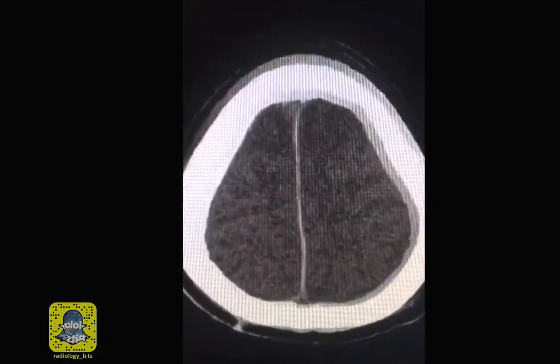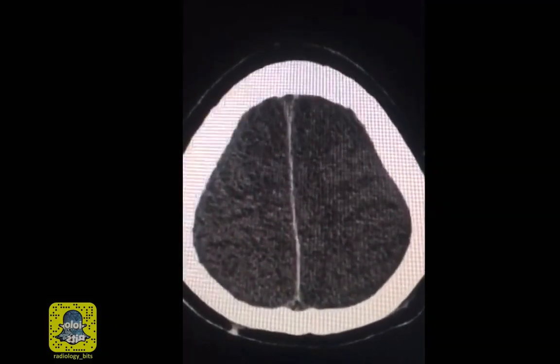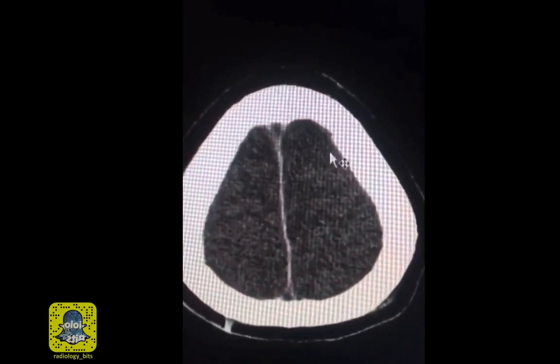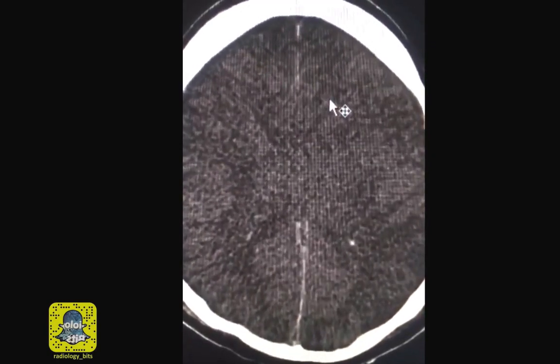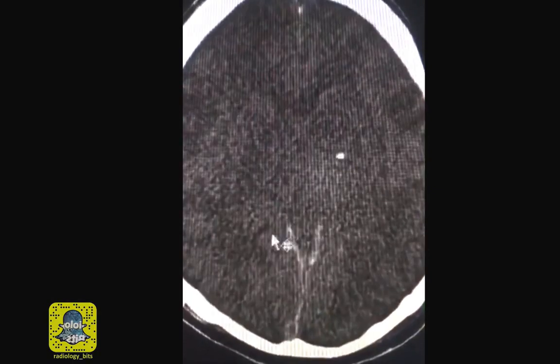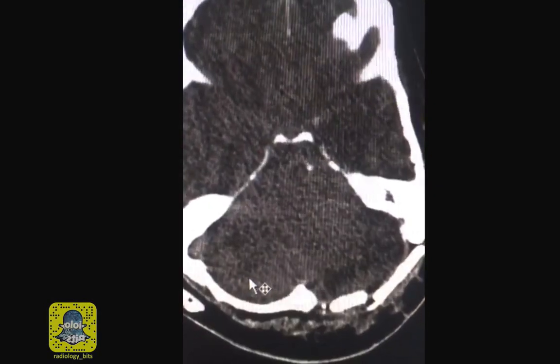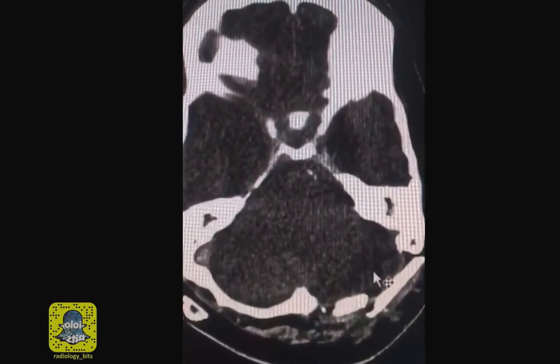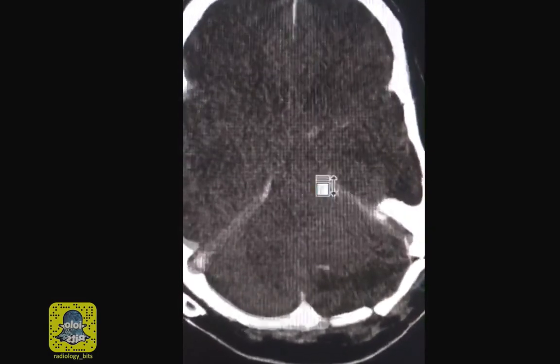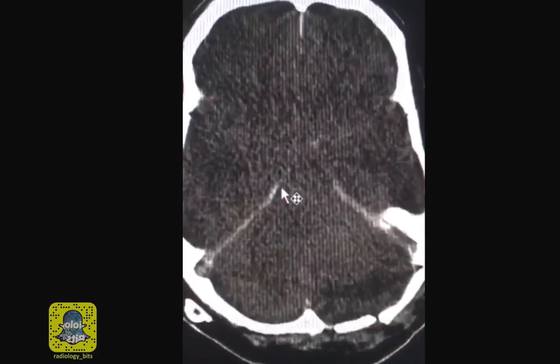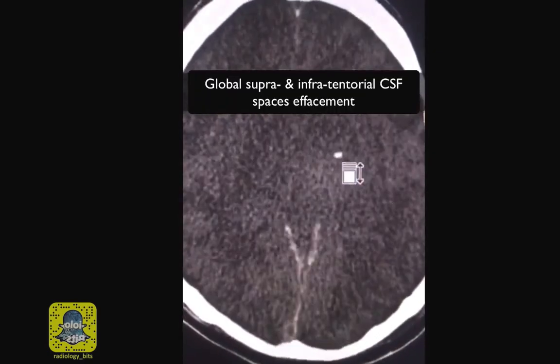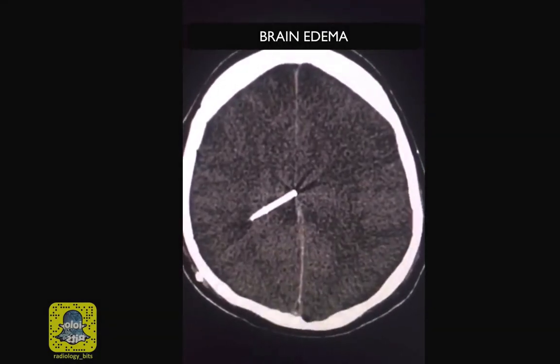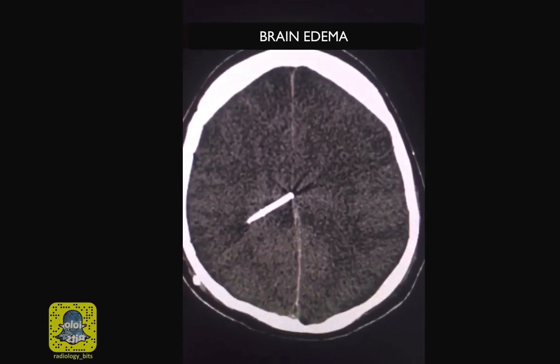I'm showing you this to notice that you have no CSF spaces at all. There is diffuse effacement and obliteration of the sulci, so you don't see the dark lines you'd expect to see. You don't even see the ventricular system — it's completely effaced and compressed. The CSF fluid in between folds in the cerebellum, called folia, are also obliterated. The cisterns extending around the brain stem are also absent. So in general you have obliteration of the CSF spaces above and below the tentorium.